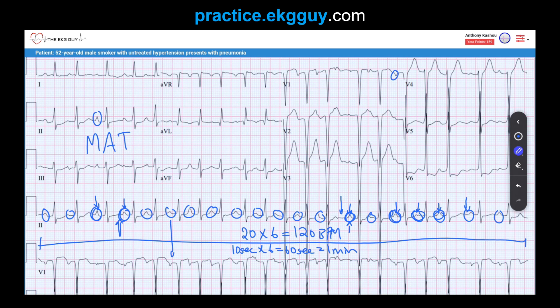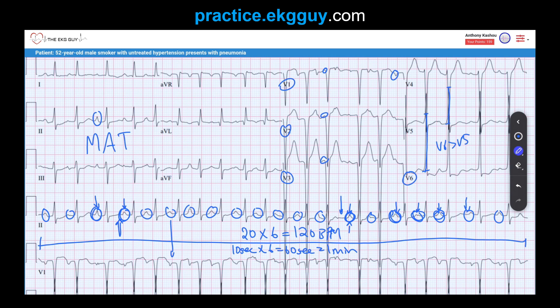Non-voltage LVH findings include absent R-waves in V1 to V3 — essentially no R-waves at all, indicating poor anterior forces and poor R-wave progression. Additionally, the R-wave amplitude in V6 is greater than in V5. Also notable is the absence of any Q-wave in leads I, V5, and V6 — those lateral leads — which helps support the LVH diagnosis.